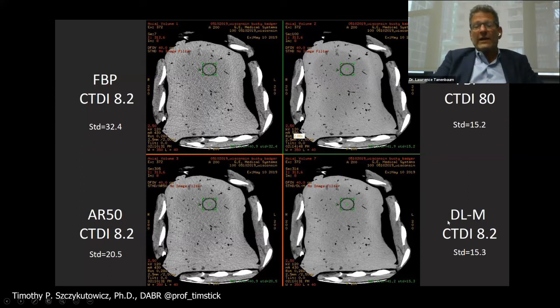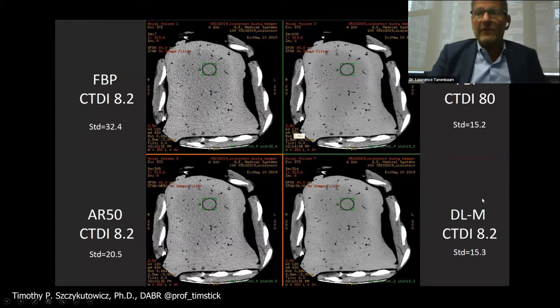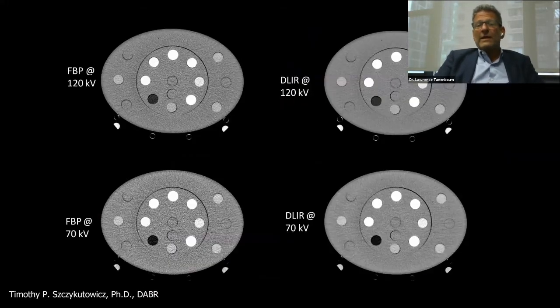Using deep learning reconstruction, you can see that the image looks very similar, the noise level is very similar, yet we're using only 10% of the dose. So this really is a nice testimonial that we can get away with a lot less dose with these tools. Now, as opposed to the traditional versions of iterative reconstruction that are out there, the quantitative integrity of CT data is maintained with deep learning, where it is actually lost with the traditional iterative reconstruction techniques. Here you can see comparing filtered back projection at 120 kV and 70 kV on the left to 120 kV, 70 kV on the right, but using the deep learning reconstruction.